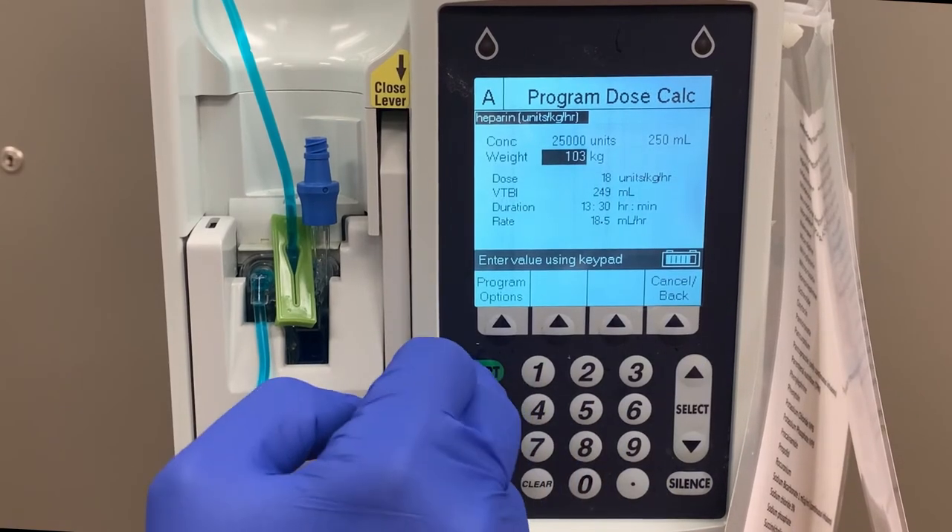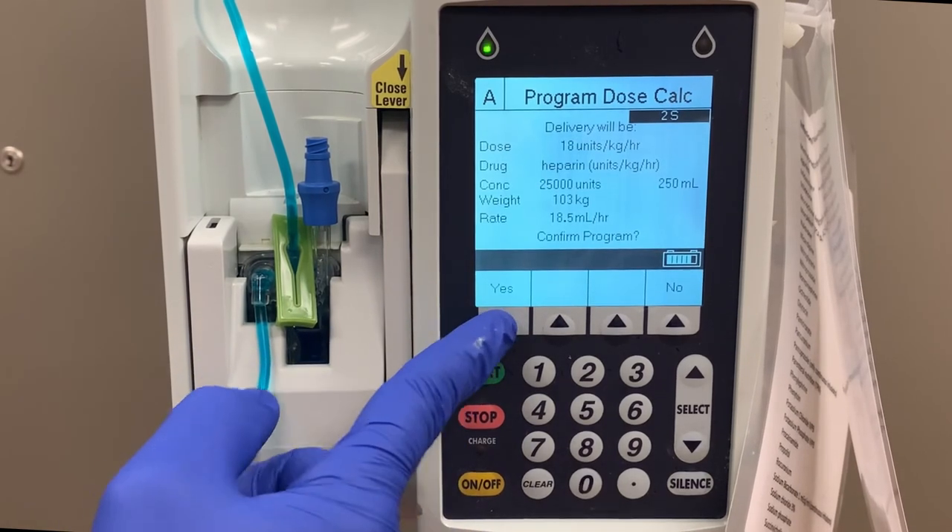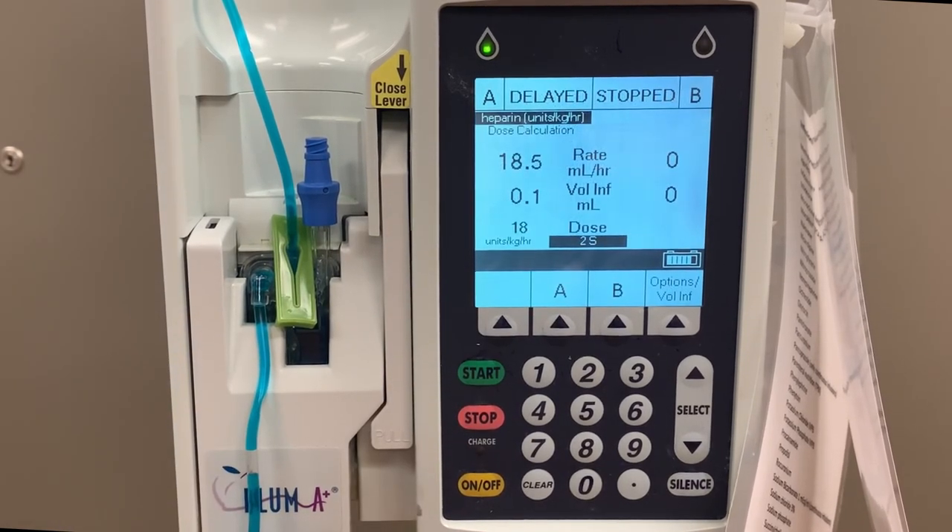Once your program is complete, press Start. Review that the program is correct and press Yes. And now you'll see that instead of saying Pumping or Stopped, the A-line says Delayed. In 30 minutes, when the infusion resumes, this will change to Pumping.